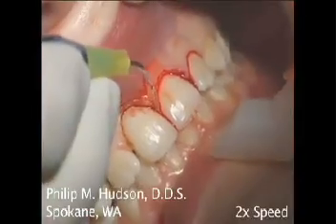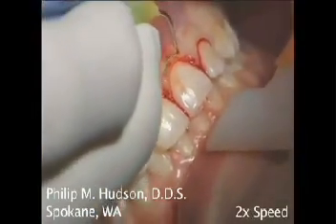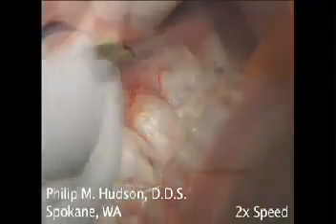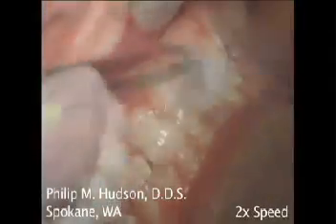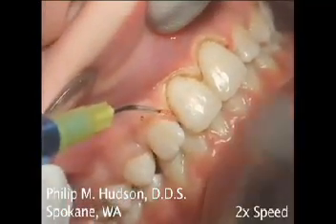Dr. Hudson will now reintroduce the laser. Immediately, he establishes hemostasis, and that allows him to continue to proceed with a clear field of view. He then proceeds with the laser on the contralateral teeth.